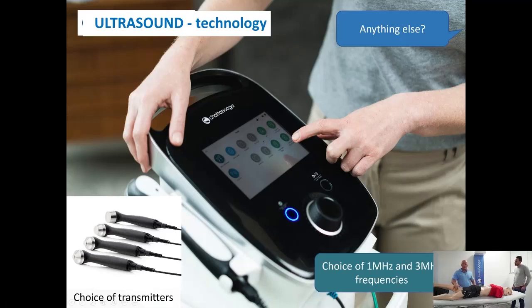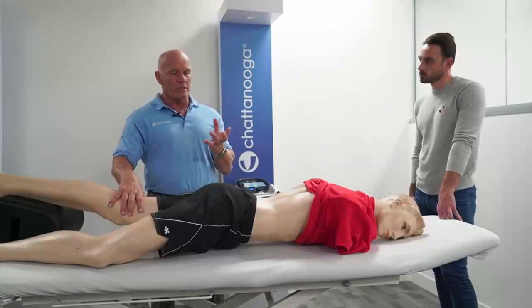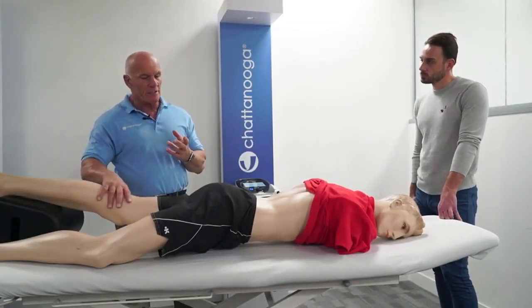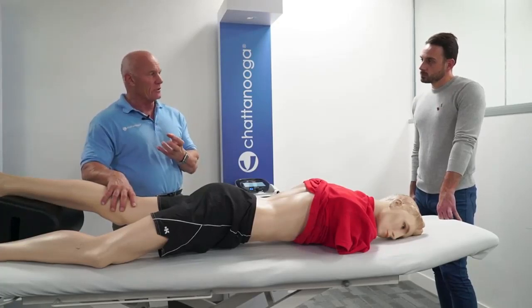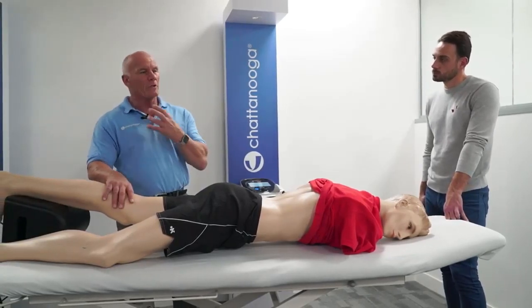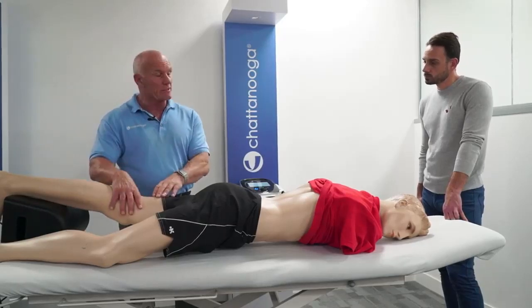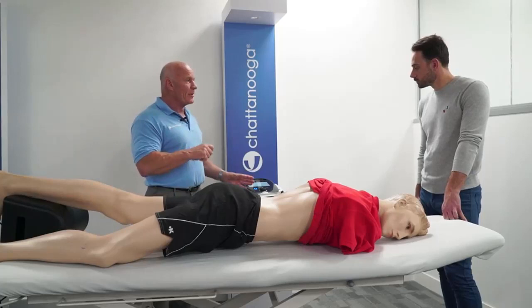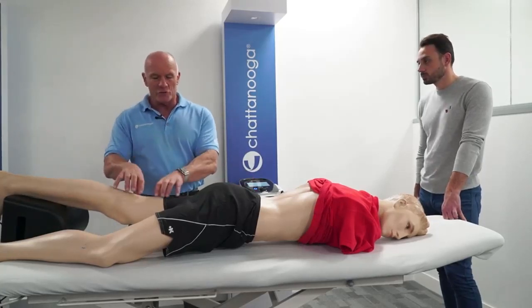And some manufacturers only give you a choice of one frequency. So they might have a 3 megahertz. Now, 3 megahertz is a frequency you use for superficial injuries down to about 2 centimetres, whereas 1 megahertz can reach, as I say, a depth down to 6 centimetres. So having a machine that has both allows you to have the choice of treating superficially or deep within the tissue.